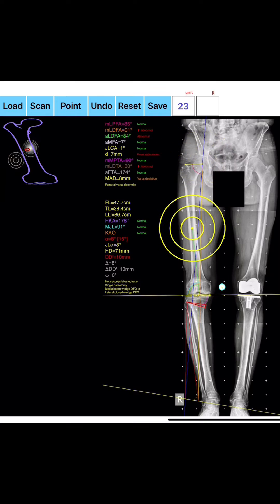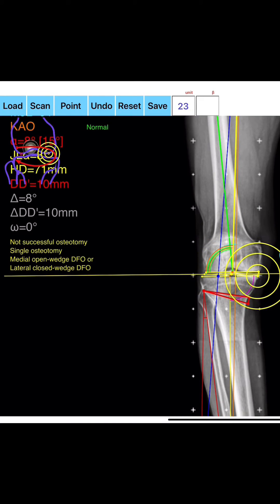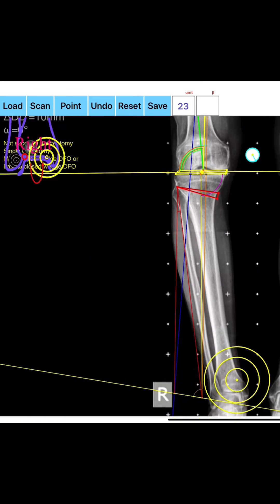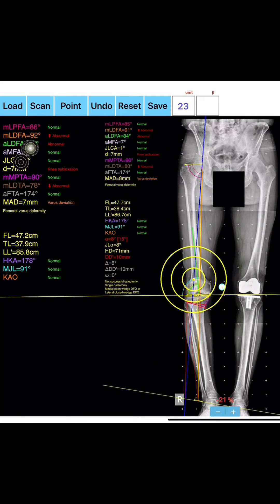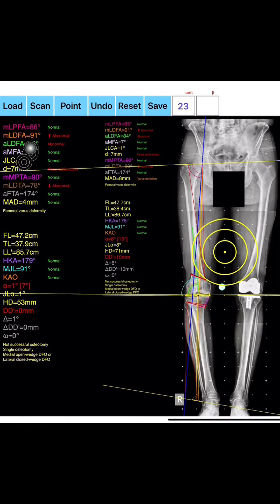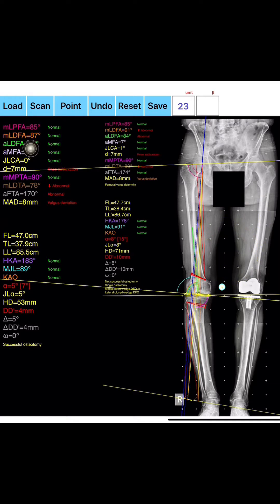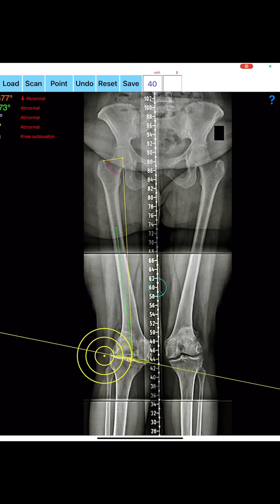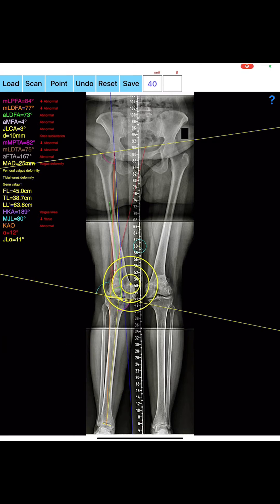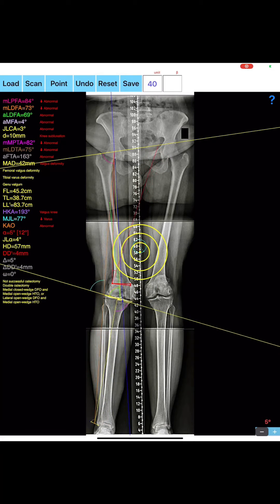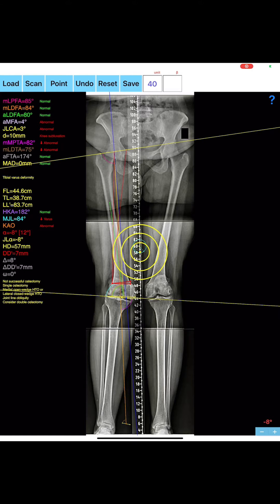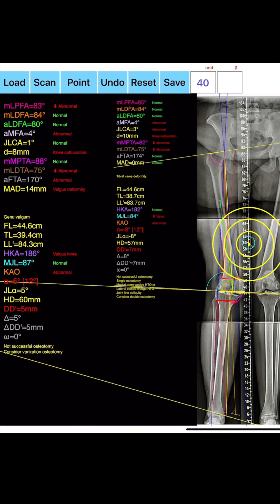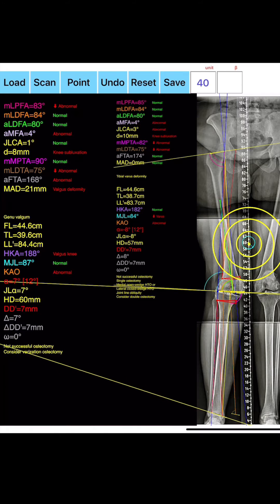The app helps to objectively categorize deviation or deformity in the frontal plane — varus or valgus — and differentiate the level of deformity, whether of femoral and/or tibial origin. According to measured angles, it objectively suggests where indicated: medial or lateral, open or closed wedge distal femur osteotomy, high tibial osteotomy, or double osteotomies.